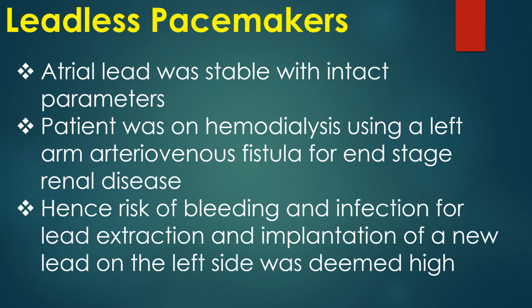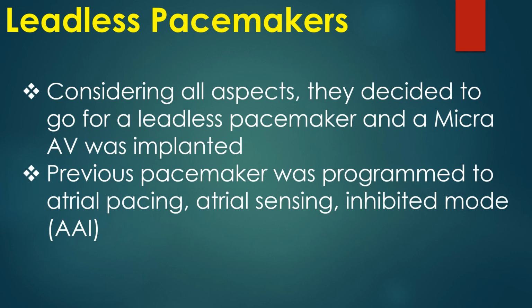Patient was on hemodialysis using a left arm arteriovenous fistula for end-stage renal disease. Hence, risk of bleeding and infection for lead extraction and implantation of a new lead on the left side was deemed high. Considering all aspects, they decided to go for a leadless pacemaker and a Micra AV was implanted.